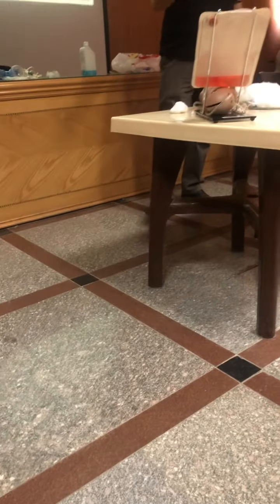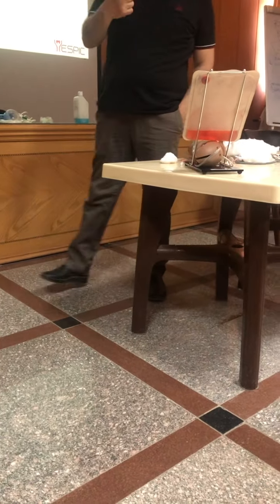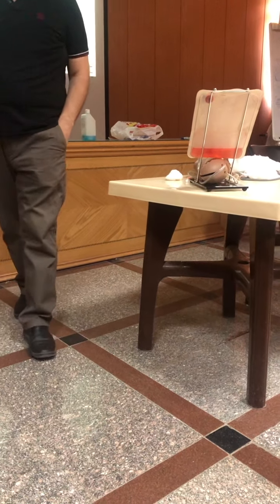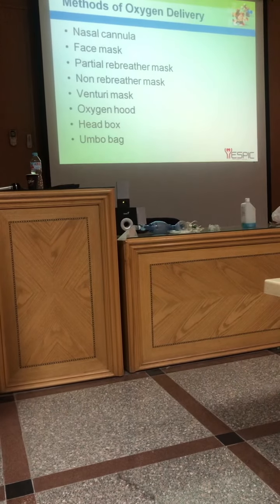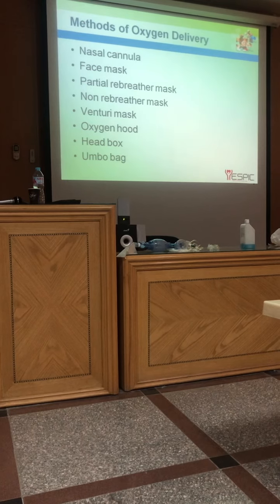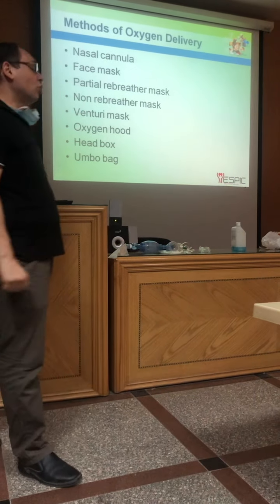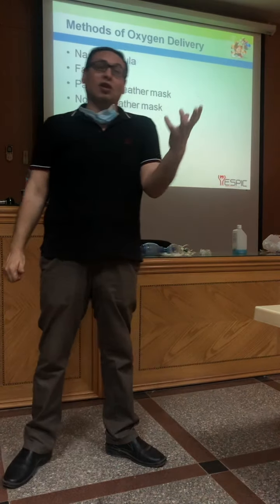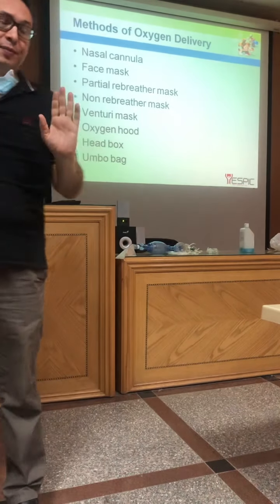Hypoxia, or critically ill, or severe respiratory problem, or in case of cardiac arrest or cardiopulmonary resuscitation. How can we give oxygen to the child? We want to know the equipment name and how much concentration of oxygen is given.